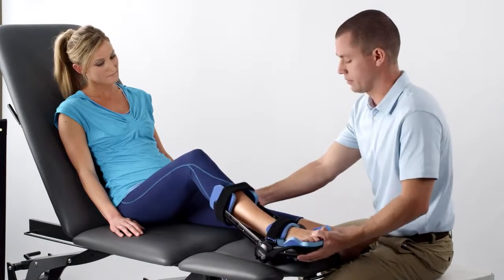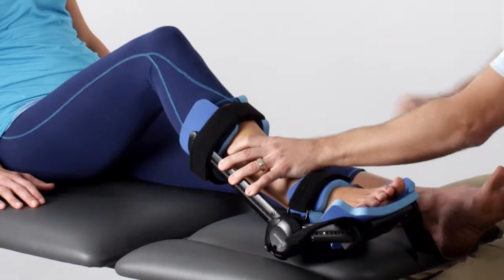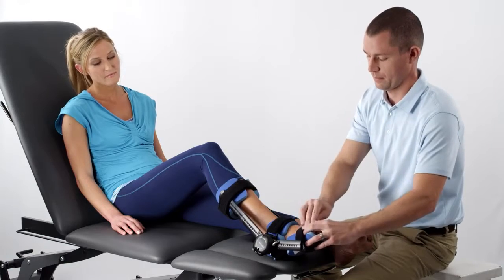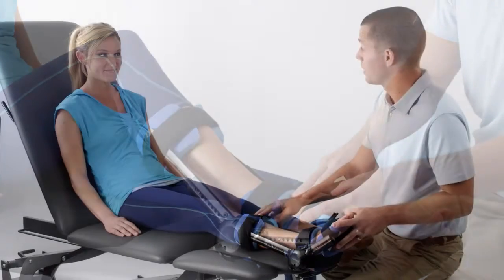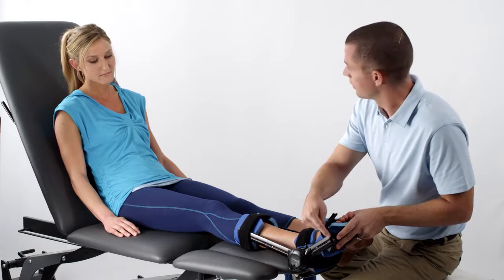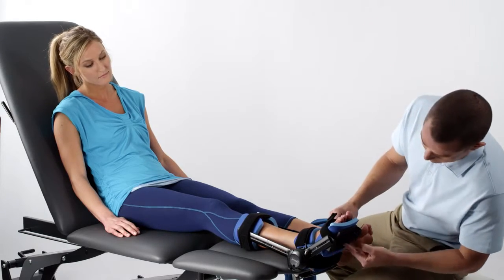To avoid pressure on the skin, position the calf strap and buckle at or near the edge of the strut. In addition, attach the strap evenly. Secure the foot strap and position the ankle foam pad to minimize any neurovascular pressure on the dorsum of the foot. The dual tension springs and adjustable length foot cradle featured on the Advanced Ankle Orthosis offer a variety of options to assist with foot positioning.